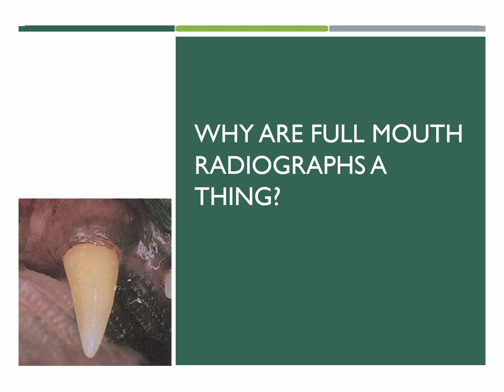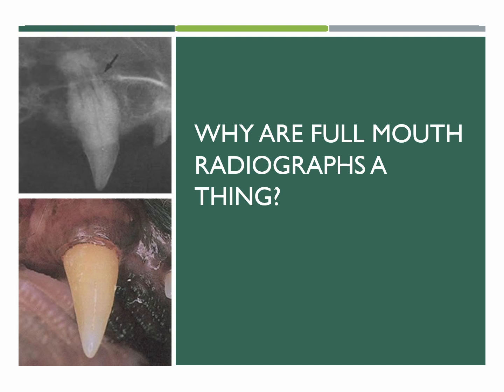Just like when we talked about anatomy, remember that if you think about a tooth like a tree, what you see isn't all what you get. There's an equal amount of tooth, or sometimes more tooth, that is in behind the gum line and in the alveolar socket that we can't see unless we radiograph it. So we might want to investigate what's happening below the surface. A lot of clinics now, when they do dentals, prophylactic dentals, full mouth radiographs are part of it. So look at that. That tooth looks healthy, but look at how much erosion of that root is below the surface. And we wouldn't know that until maybe the tooth broke and fell out.